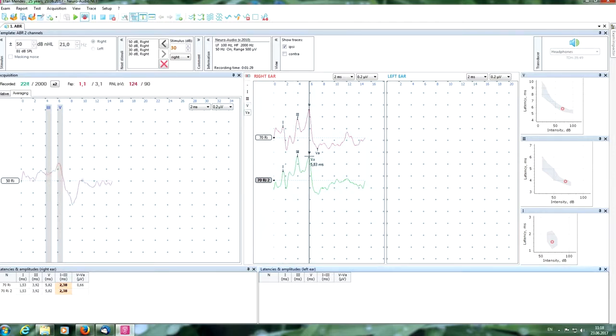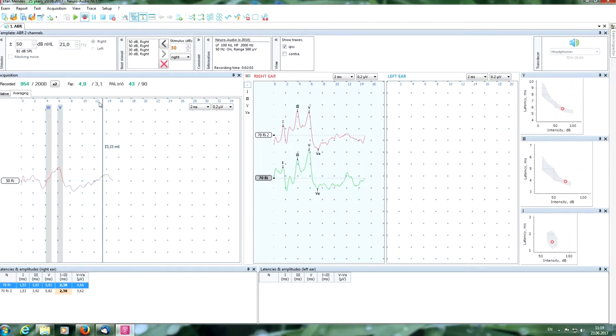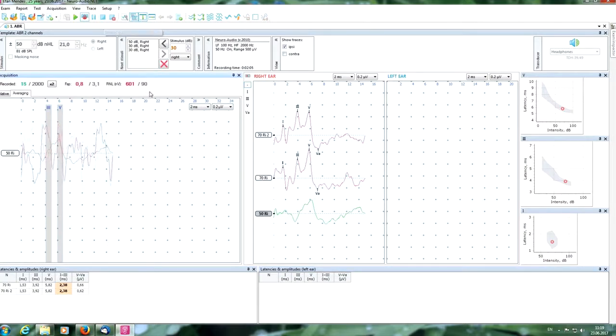If we want, we also can overlay our curves to check the reproducibility. Also we can see main latencies and amplitudes here in the table and here in the graphics of normal data. Now we get another curve. At the lower intensity we put the marker of the 5 wave and can see a new point here. It is normal latency.